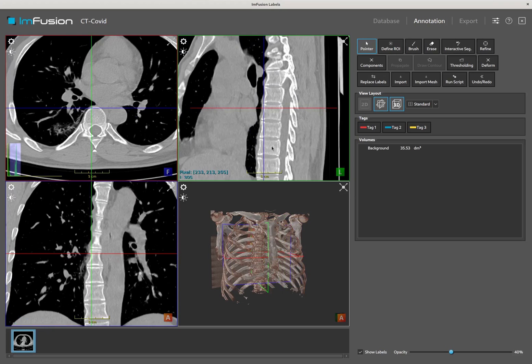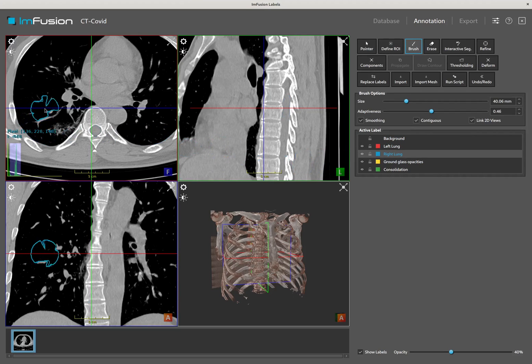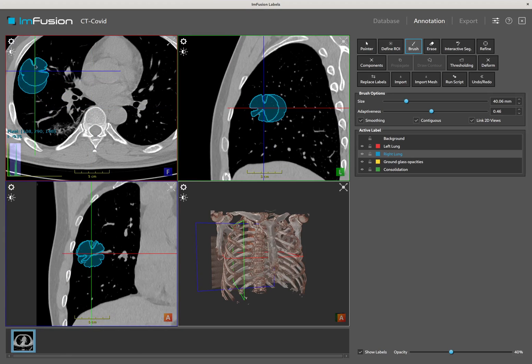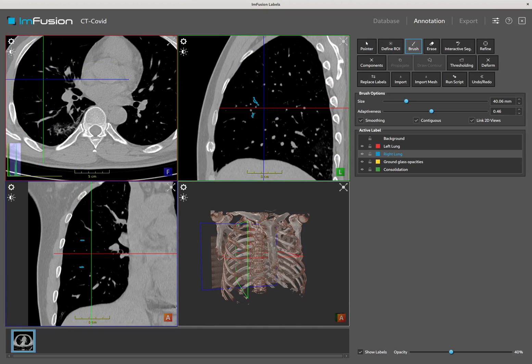Moving on to the annotation, one of the more generic tools is the brush, which can be used to interactively paint in 3D. As we move the cursor around the views, we can see a preview of the area that will be painted. The left mouse button can be used to paint inside the label map and the right mouse button to erase. Note that when painting, the result is not circular. This is because the brush takes into account the image intensities to reduce the risk of filling an undesired area.